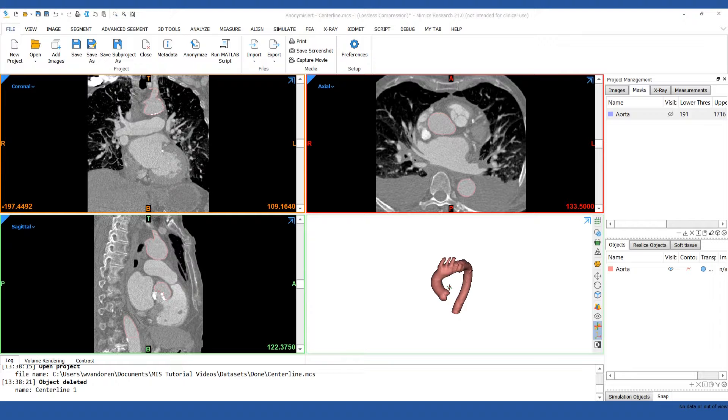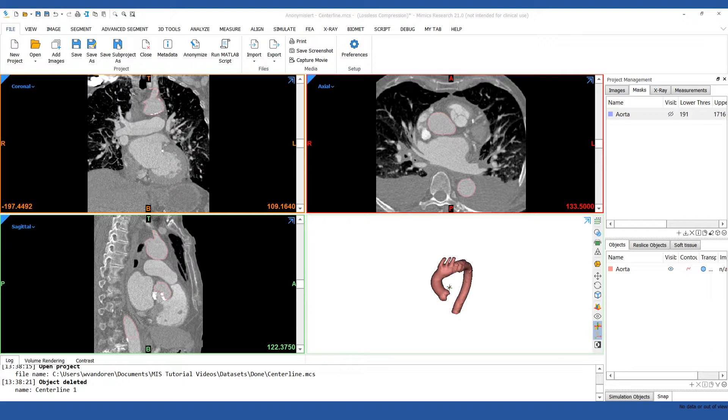We'll be using an aorta model as an example. This model is generated by first segmenting out the blood volume within the artery. If you used a hollow model depicting just the vessel walls of the aorta, the software would try to calculate the centerline inside of the walls instead of the vessel, so it's important to work with a solid part.